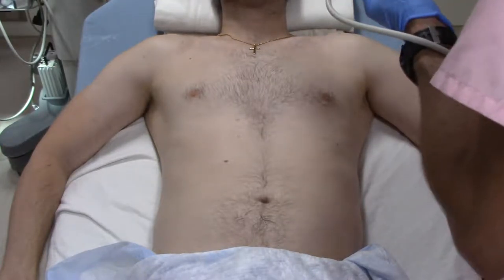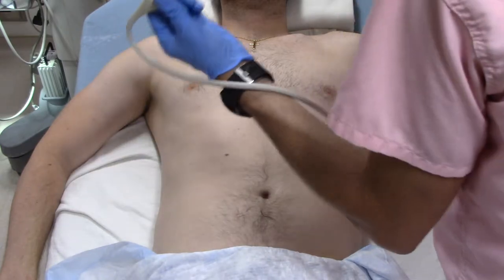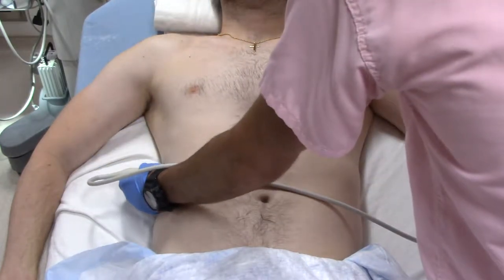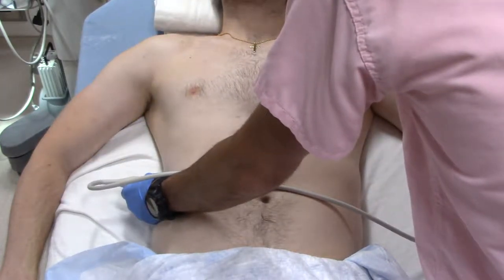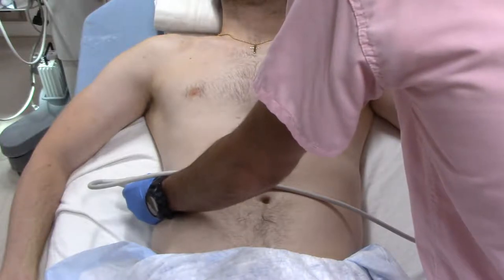For blunt abdominal trauma, we're going to start in the right upper quadrant. Indicator is going to be towards the patient's head, mid axillary line. We're going to find the hepatorenal interface.